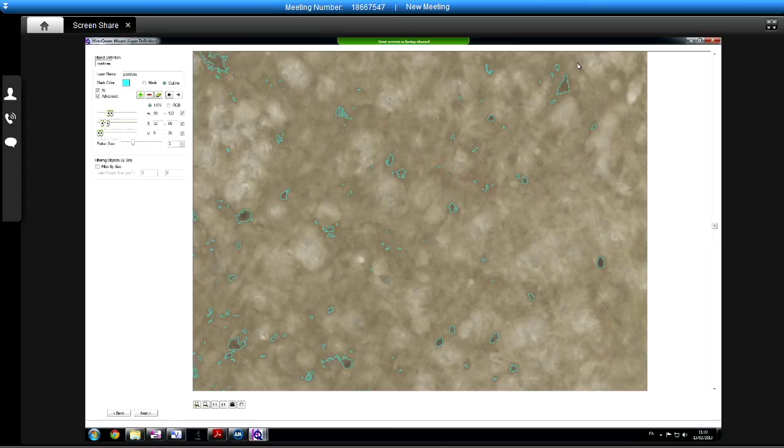That would be questionable, I think, wouldn't it? Yeah. And these little things. Okay, so let's try something else now. Let's filter by size and see how close to what you count we can get. So, little trick you can do. Do you know what size is nuclear, or should we find out?